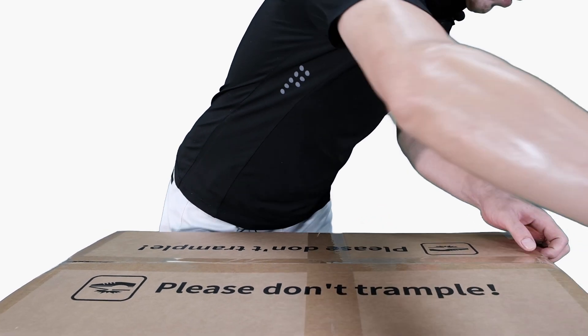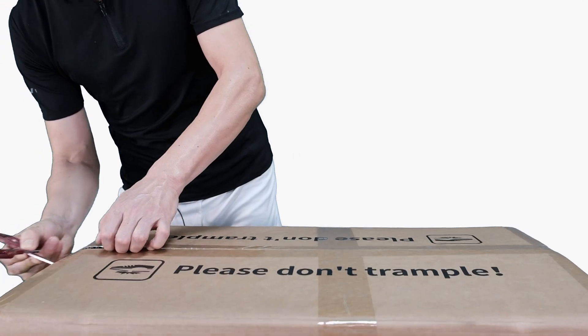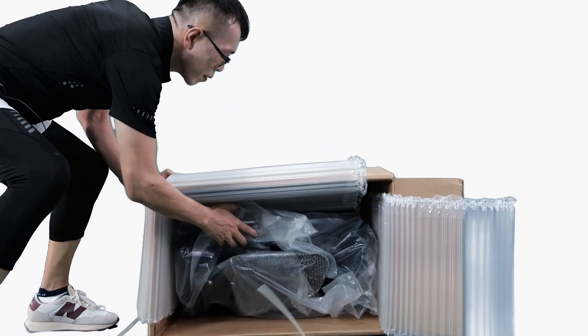First of all, let's open up the top of the carton by cutting the stripes off and also the tapes off so that we can open up the carton. Then we can lay the whole carton down to allow us to drag out the unit.